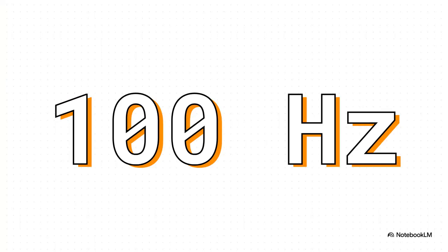Before we can modulate anything at all, we've got to understand how these medium-frequency alternating currents actually interact when they cross paths deep inside the patient's body. Let's look at the math for a second. IFT uses two medium-frequency currents, right? So say current 1 is humming along at 4,000 Hz, and current 2 is set slightly higher at 4,100 Hz.